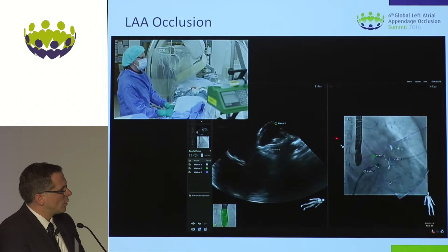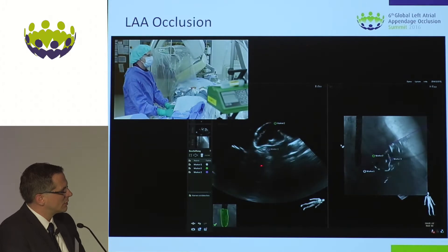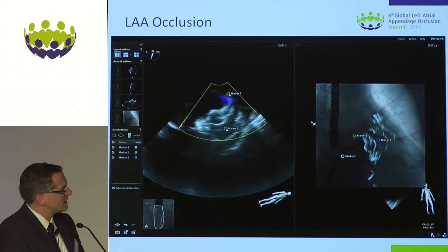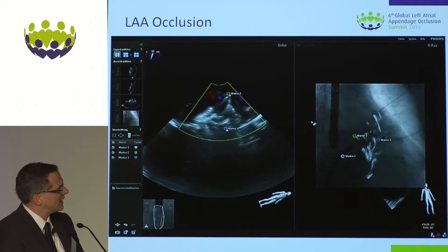With this new position you are deeper and you can clearly see that the circumflex artery is here and the device is well within the left atrial appendage.